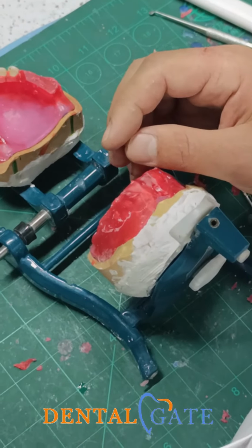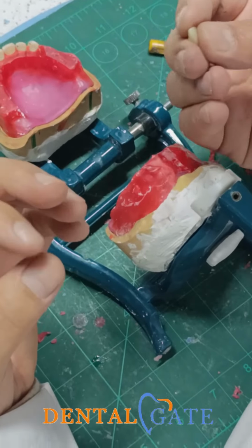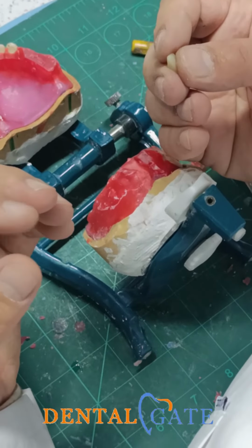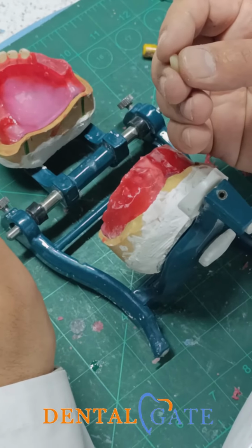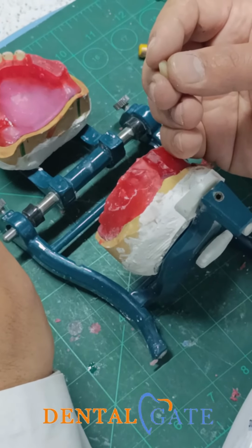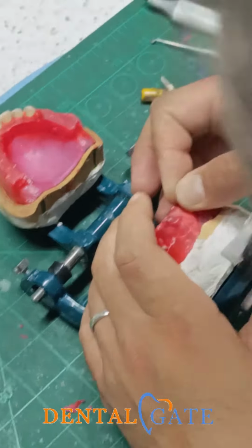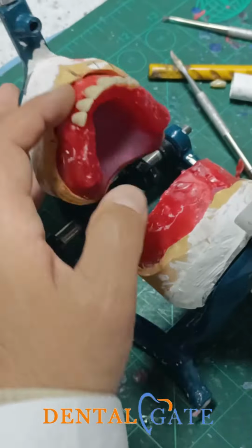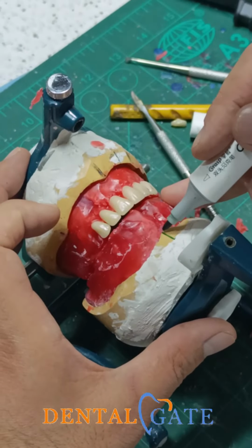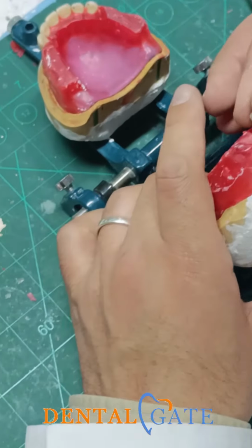The criteria, to start with one point: I need to put the central incisor of the lower teeth parallel to the vertical axis, in the same principle as in the upper central incisor. You can see the long axis should be parallel to the vertical axis. If you want to make the parallel axis here, this is a parallel axis, so it should be parallel to this vertical axis, okay?